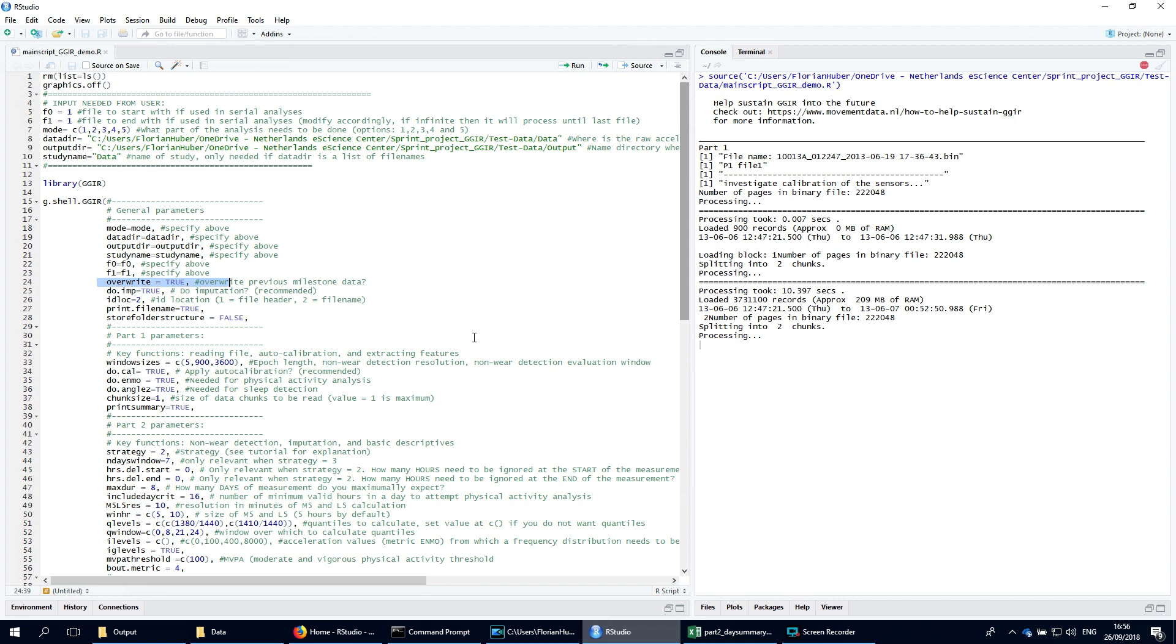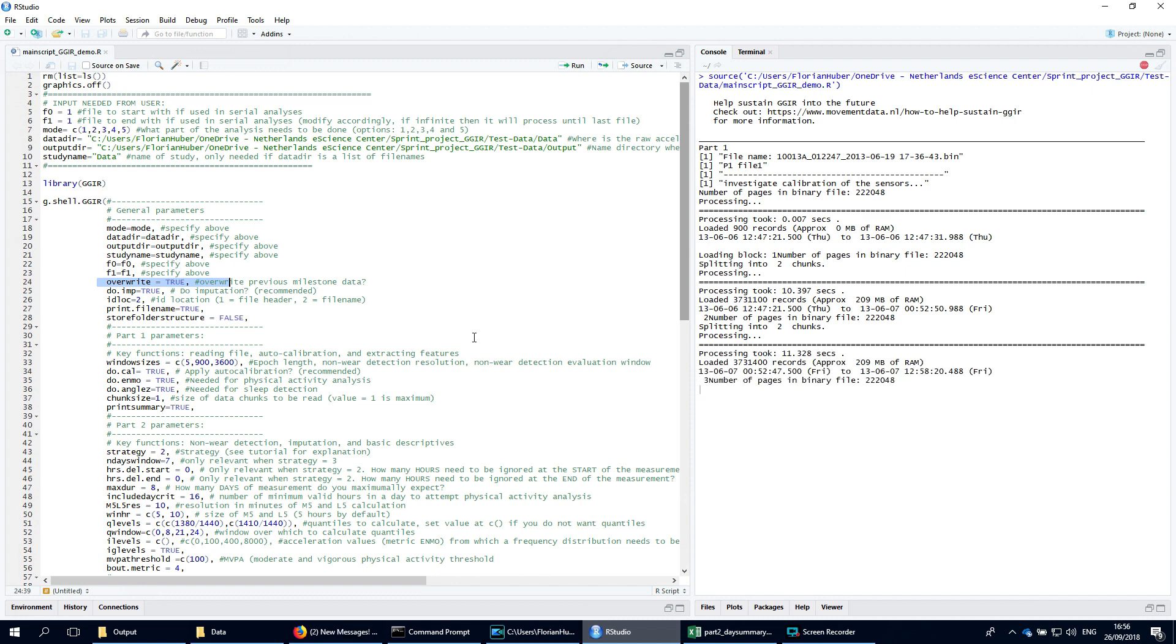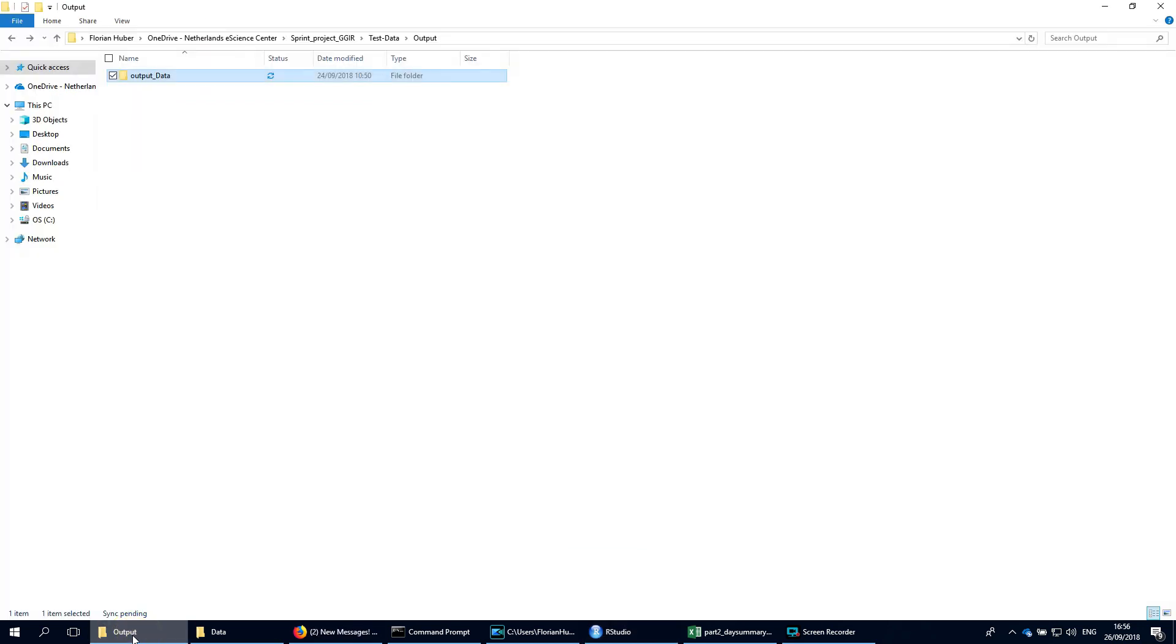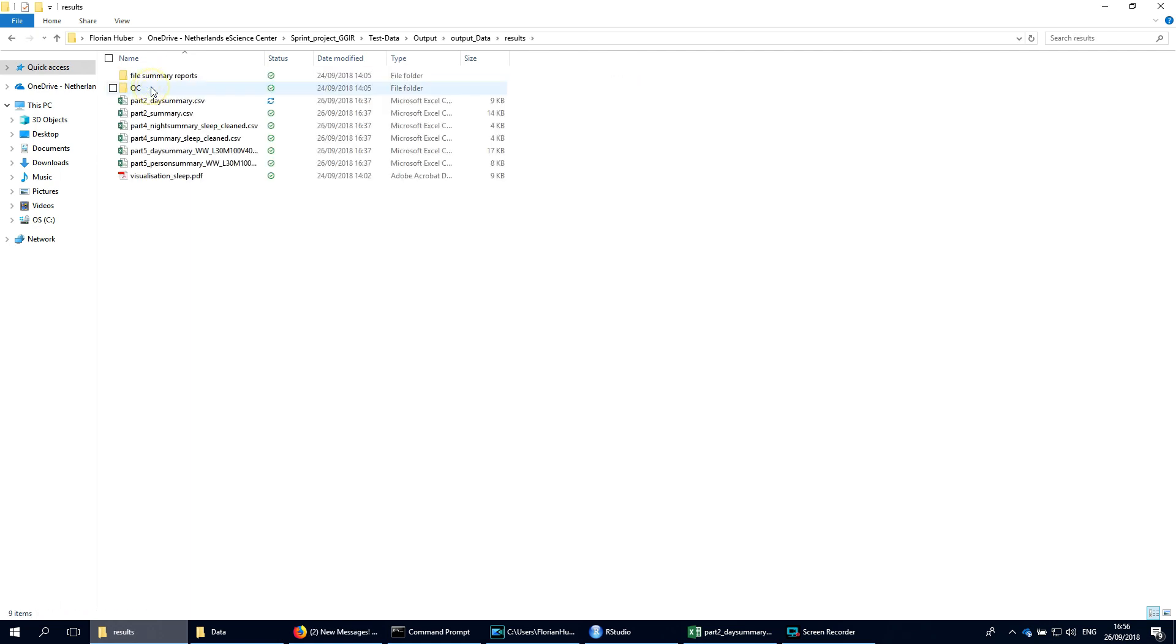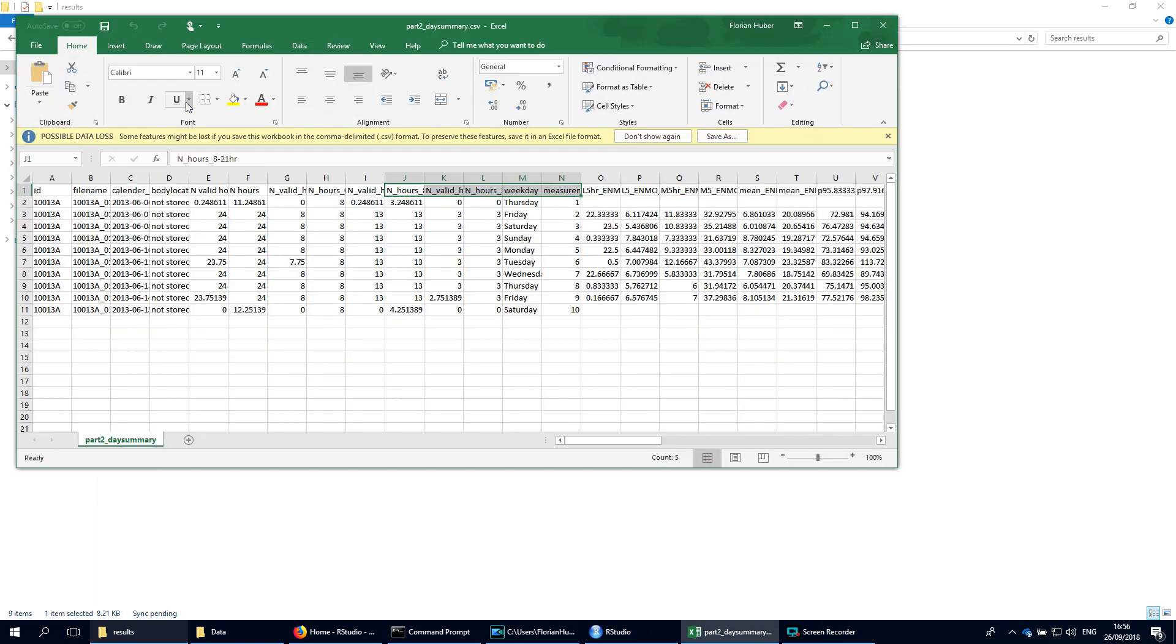Next time you could set argument overwrite to false, as I previously explained, to avoid having to process the data twice. Once the processing has finished, we can inspect the output, which is stored in an automatically created folder structure. Let's open one of the files. The meaning of all the variables in the CSV reports are explained in the package documentation.